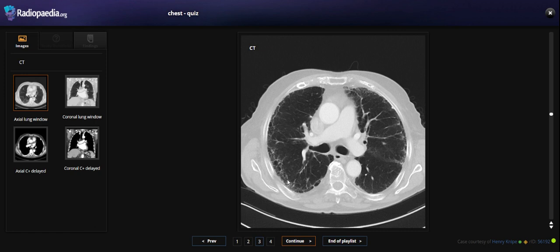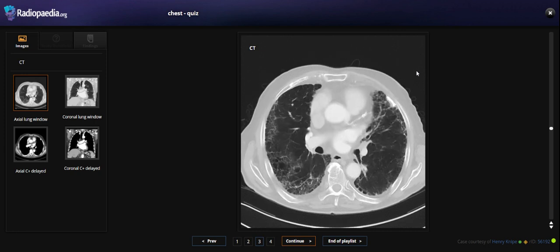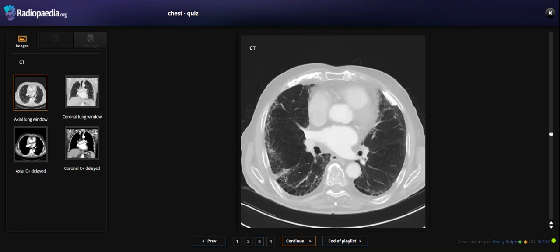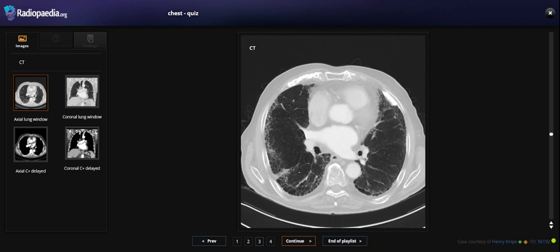We see a reticular pattern, mostly in the lungs, and we see fibrotic changes.